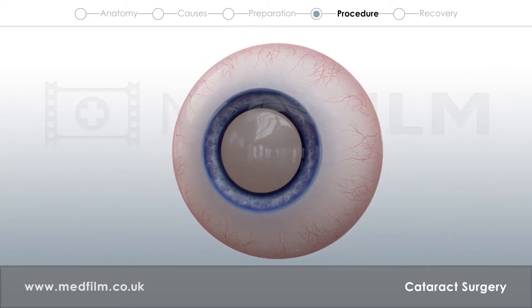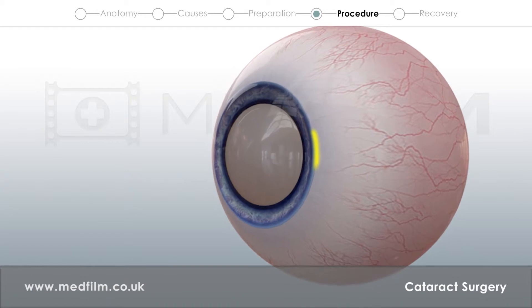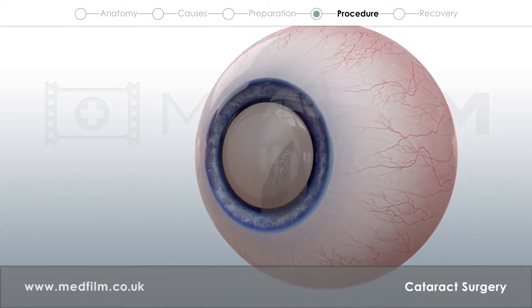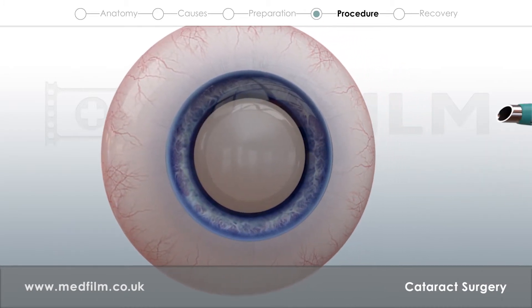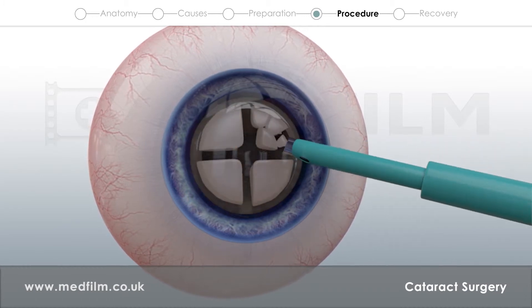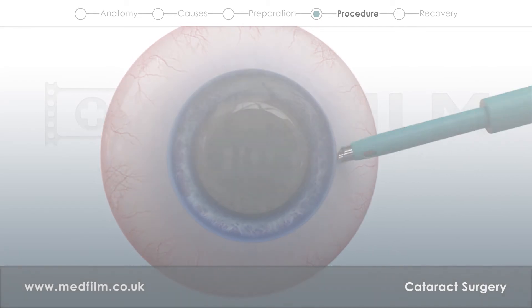After the topical anesthesia has taken effect, a 2 mm incision is made in the corner of the cornea. The front side of the capsule containing the lens is removed. With the help of a special ultrasound instrument, the lens is broken down and pumped out of the capsule in tiny pieces.